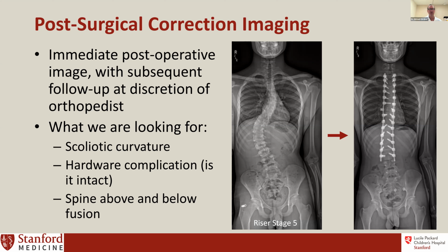Yeah, great answer. So here's a good one. John asks, great question: when you're measuring a Cobb angle from one series to the next, how do you decide which vertebral body to use as the reference points for each end? And when you get one six months later, do you make sure to use the same vertebral bodies as the previous, or do you pick the most appropriate on that given study?